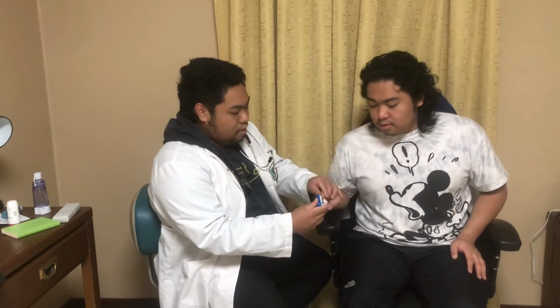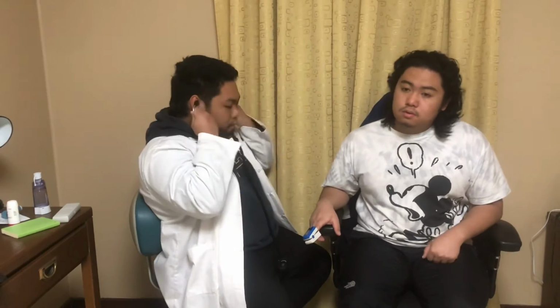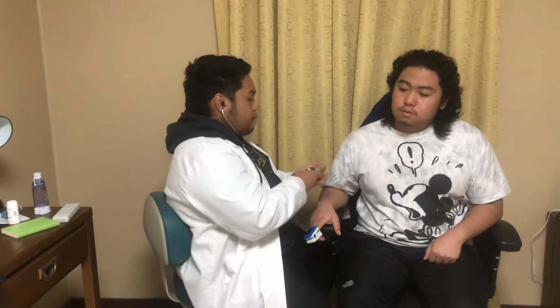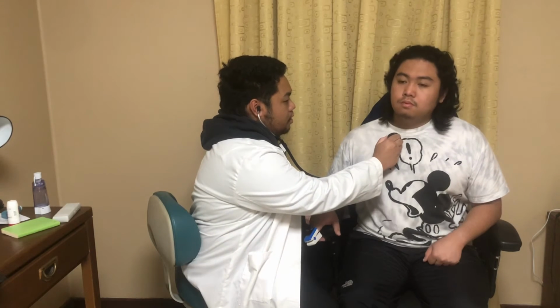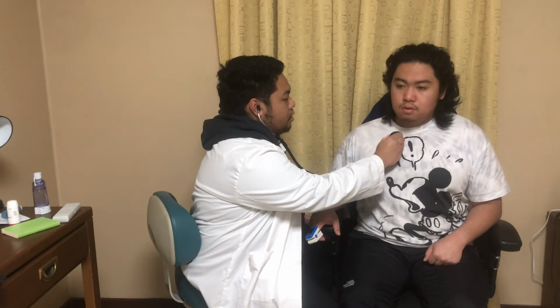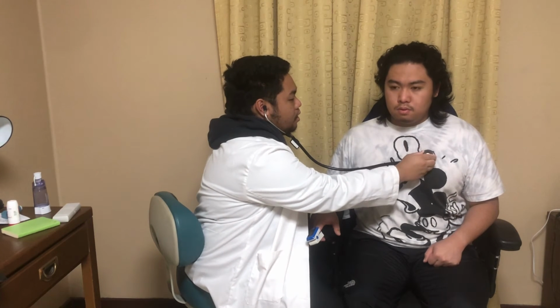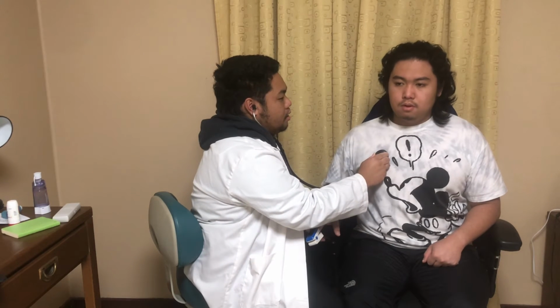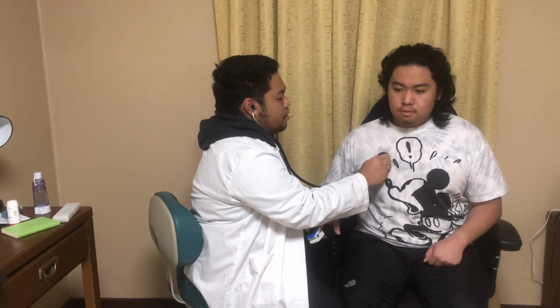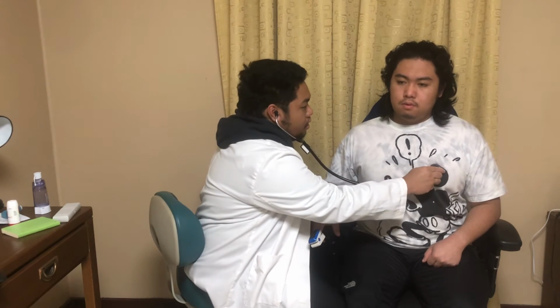Yes sir, let's go like this. Same procedure, inhale, exhale. Inhale, exhale. Inhale, exhale.